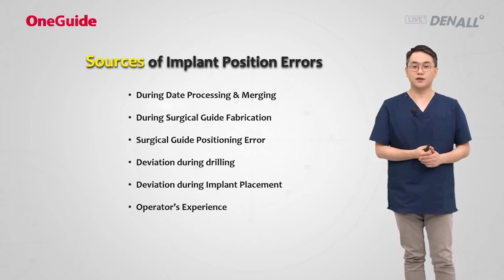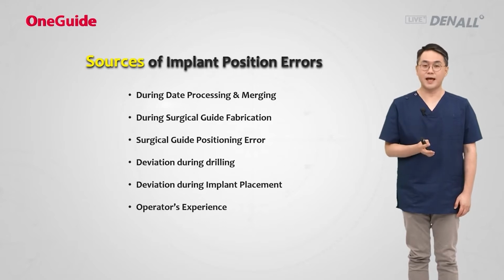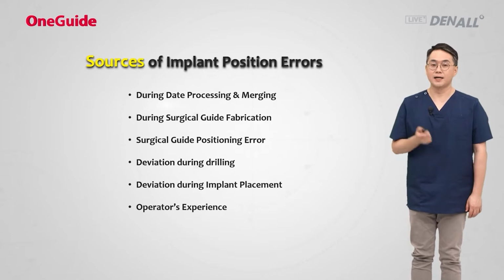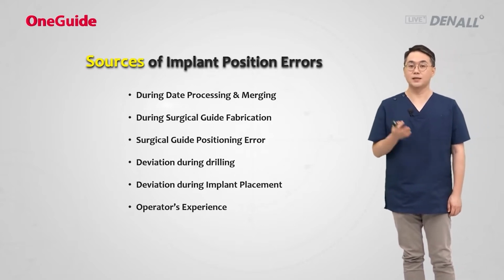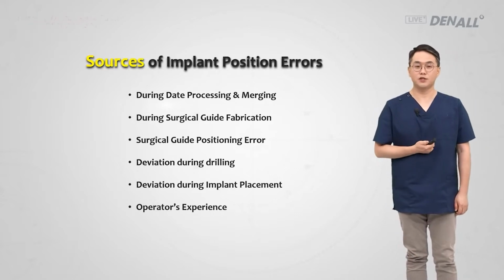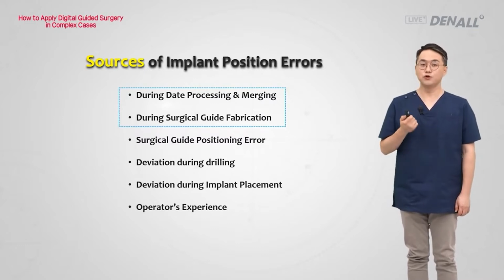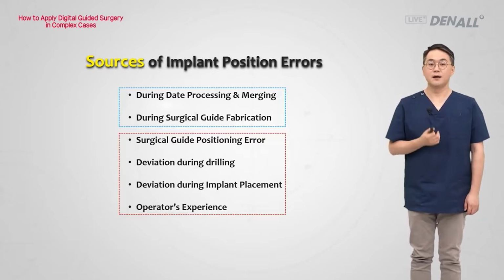In order to do the guided surgery accurately, we need to do a lot of preparation before the surgery, and many things need to be considered during the surgery. As I began to do the digital guided surgery, I have analyzed the sources of the errors that can occur before the surgery and during the surgery.